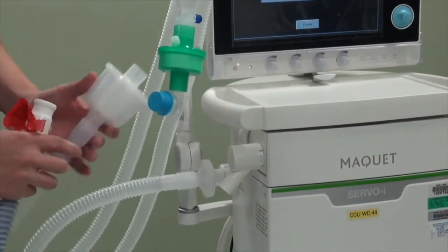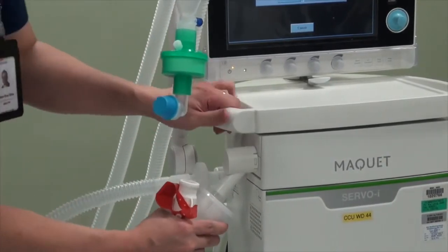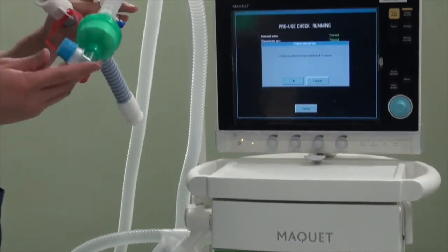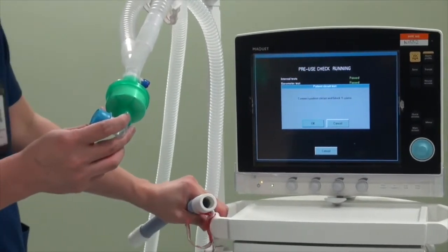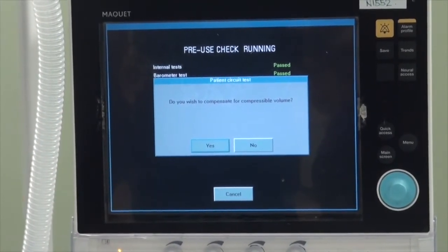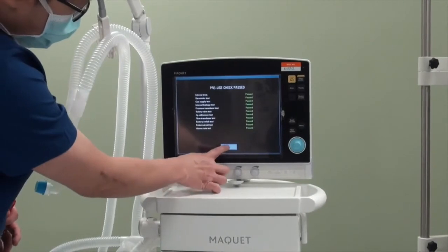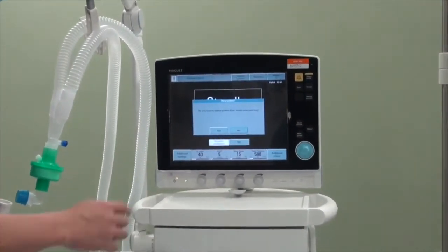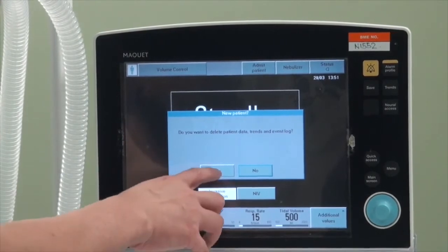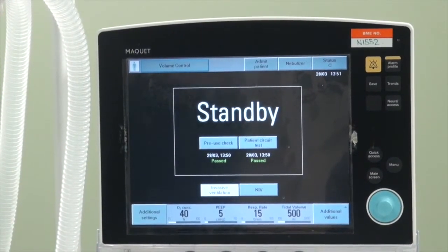Connect the expiratory exhaust with the pre-installed hygrofilter. Make sure that both are very tight and there's no leak. They also ask you to put in the block at the wye connector. Once done, press OK. When prompted whether to compensate for compressible volume, always select yes. The pre-use check has passed — click OK. You'll then be asked whether to erase previous user settings; if this is for a new patient, select yes. You are then ready to set the settings for the new patient.